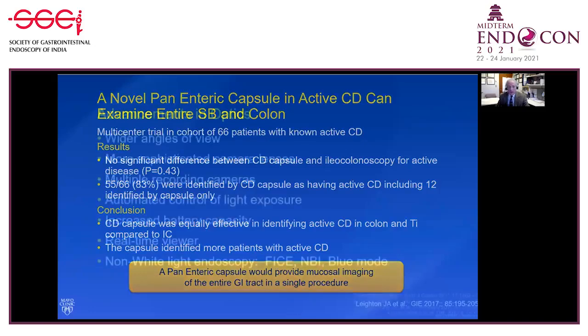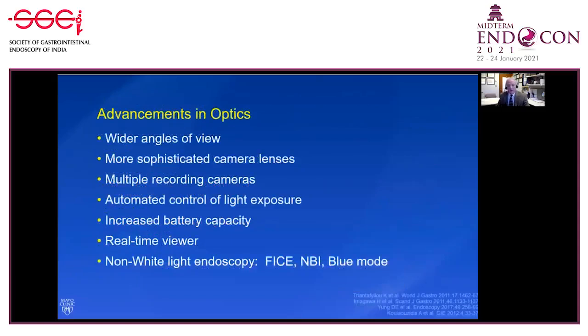So very exciting. And then other advancement in the optics, we continue to see wider angles of view, more sophisticated lenses, multiple recording cameras, automated control of light, increased battery capacity, real-time viewers, and non-white light endoscopy, which I find very exciting.